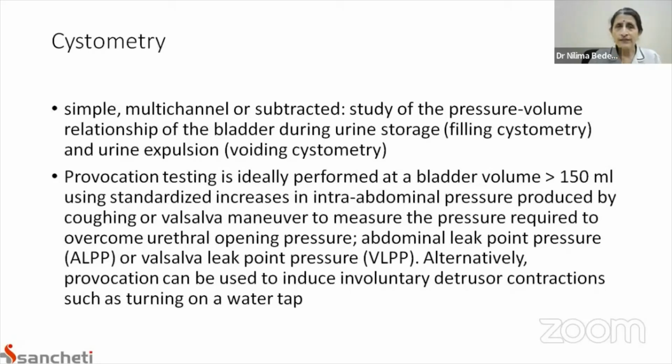So the gold standard cystometry is a simple multi-channel or subtractive study of the pressure-volume relationship of the bladder during the urine storage stage. So this is the filling cystometry and the voiding cystometry.